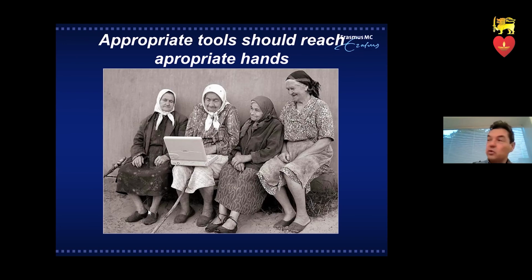The 1.5 or 2 millimeters overexpansion is usually possible. So my advice would be size distally and over-dilate the proximal main with the POT. But be sure that you choose your stent with a size to the distal main, but has the proximal overexpansion capabilities to fit in your proximal left main.